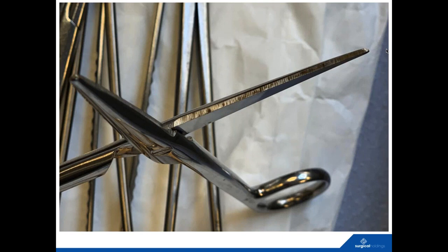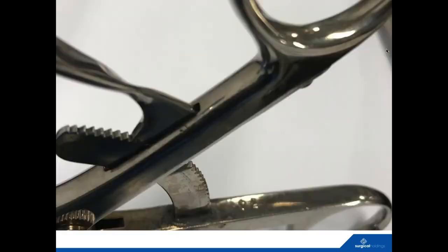Yeah, absolutely. And when it looks like this, it's very hard to tell the difference between corrosion and bioburden. So again, it points us back to that lighted magnification, so we can really see what's going on with the instrument. Yeah, indeed.